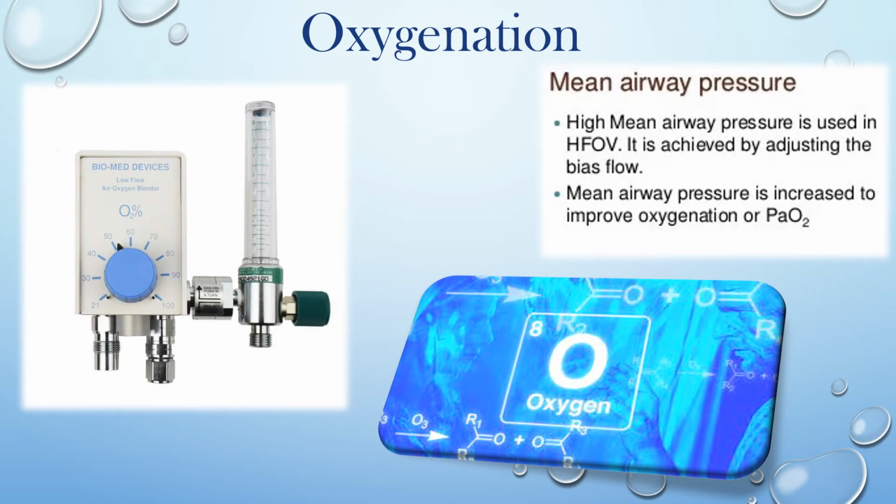Adequate lung expansion is accomplished by the visualization of the 9th posterior rib above the level of the diaphragm. As mean airway pressure increases, the volume in the lung increases and the patient's diaphragm is displaced downward. Placement of the diaphragm via chest X-ray usually correlates to an acceptable PaO2. The mean airway pressure should not be reduced during the first 24 hours to permit an adequate amount of time for alveolar recruitment.